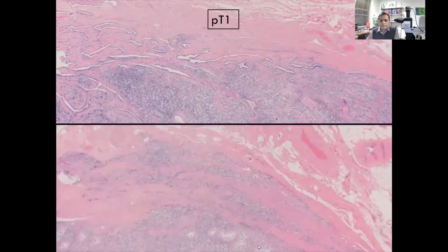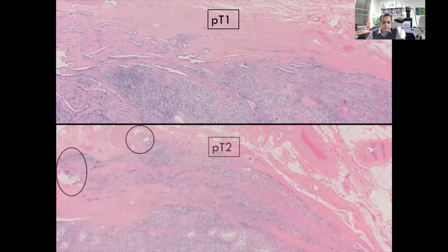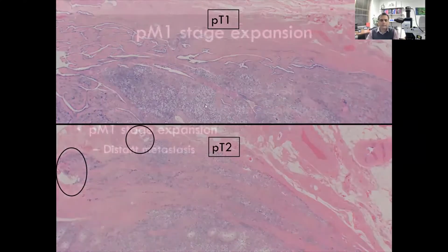And in this example, you can see a seminoma that is extensively involving the tunica albuginea and the hilar area. If you observe carefully, you can also see that it's extending into the hilar adipose tissue. And this would be a pT2 in the new staging system.